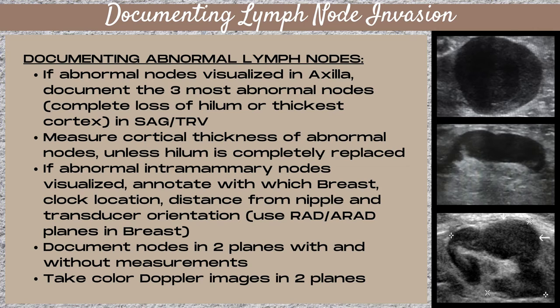Also take a color Doppler image in each plane. Ensure that you have three measurements: a length, a width, and a height — two horizontal measurements and one vertical measurement. If you come across an abnormal intramammary node while scanning, the only difference in documentation is that within the breast you use radial and anti-radial planes rather than sagittal and transverse planes as you would in the axilla.